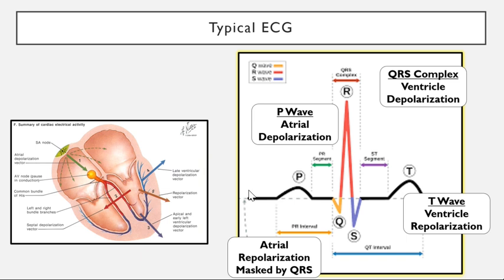And you can see here between the S and the T, that ST segment right there, and that was really important for the type of myocardial infarction you have, insofar as if you have an NSTEMI versus a STEMI, right? An ST segment elevation myocardial infarction.